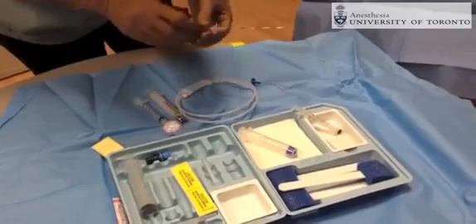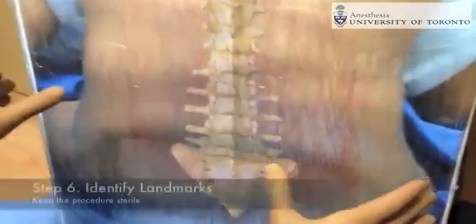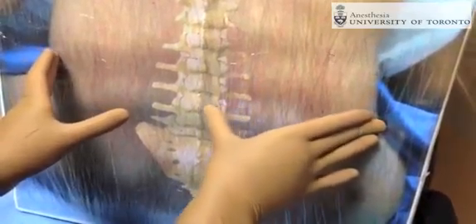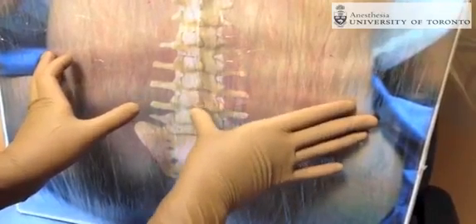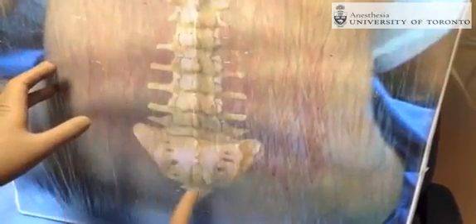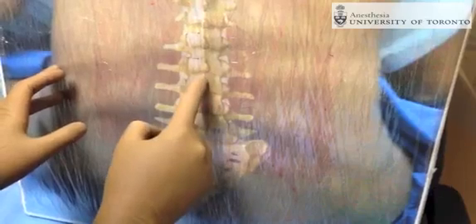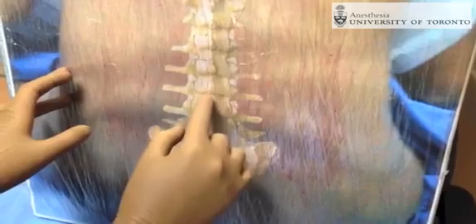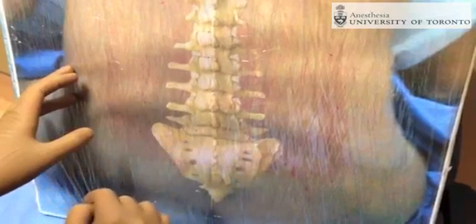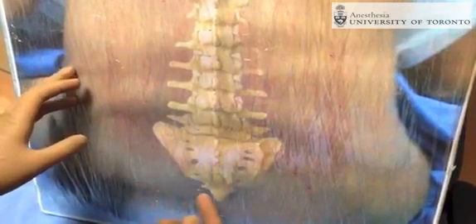Now that the prep has dried on the patient's back, to landmark the epidural, one palpates the patient on the posterior superior iliac crest to identify either the L2-3 or L3-4 interspaces. On this patient model, the sacrum, L5, L4, L3, and L2 vertebrae are delineated. The target for a labor epidural is the L2-3 or L3-4 interspace, though occasionally one needs to go down to L4-5 due to patient anatomical considerations.